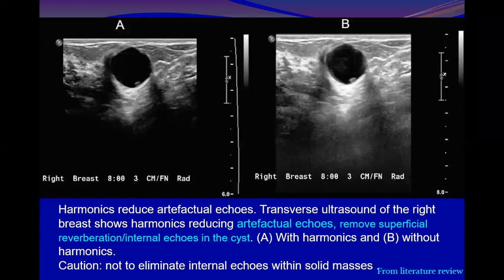The enhancement is more in the harmonics, the posterior enhancement. I'm not talking about posterior structure. No, not seen here. Yes. Why? What do you think?